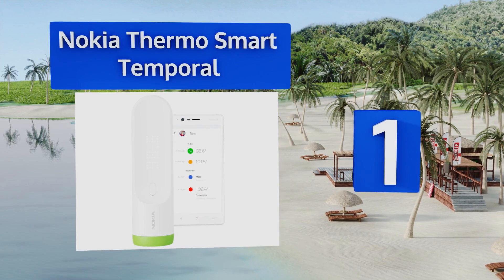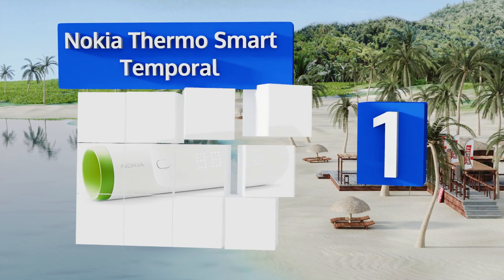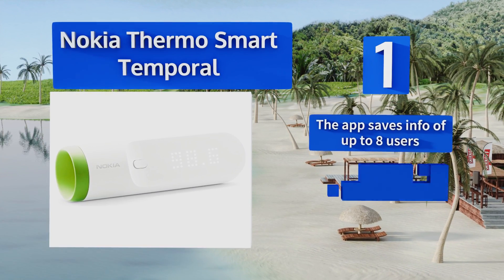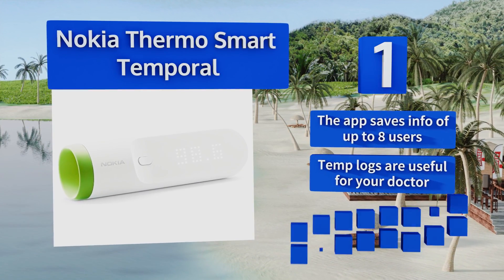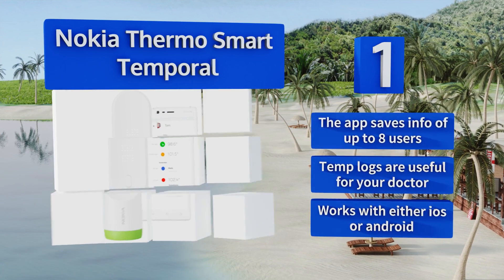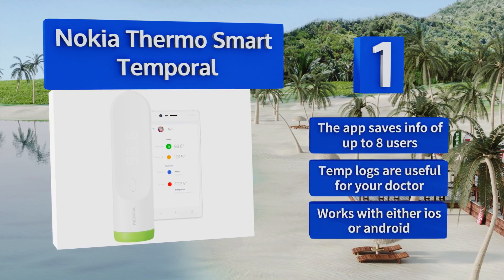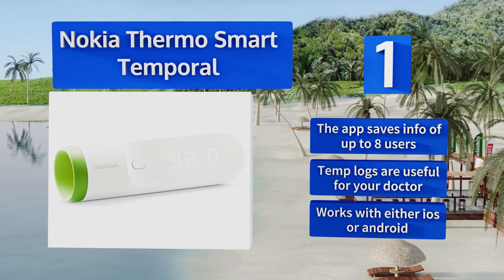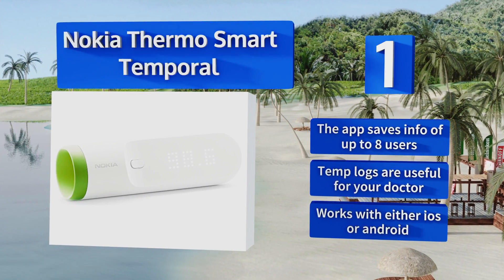Coming in at number one on our list, the Nokia Thermo Smart Temporal utilizes 16 infrared sensors to ensure that its measurement is precise. Its sleek design mirrors the slick, minimalist interface of the app it pairs with. Technophobes need not worry though — it can also be used as a standalone product. The app saves information for up to eight users and the temperature logs are useful for your doctor. It works with either iOS or Android devices.